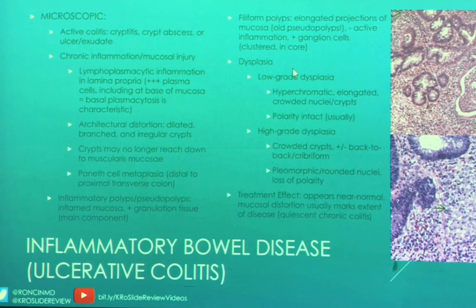We have a little bit here about low-grade versus high-grade dysplasia. Didn't really appreciate dysplasia in our case, but there wasn't a whole heck of a lot to work with either. I think what happened with ours is that there was some treatment effect, because the crypts themselves, even though there was distortion, it really looked quiet, so maybe some treatment effect there. Here, this looks like it's showing a loose granuloma, as well as, the rest of this looks more like lymphoplasmacytic maybe.